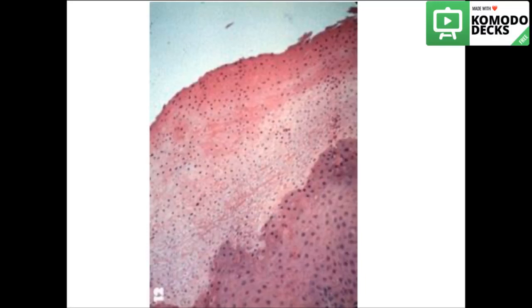You can see very mild or fewer rete ridges in here.